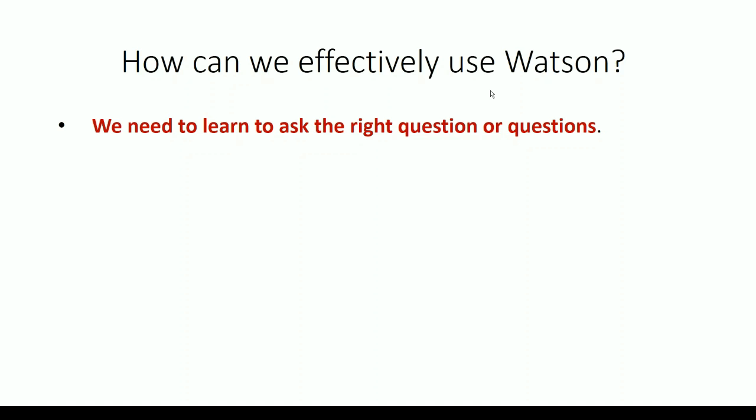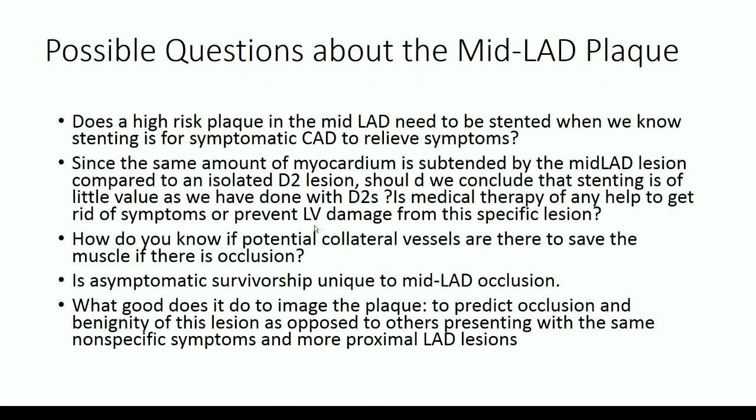So how can we effectively use Watson or cognitive computing? We need to learn to ask the right question or questions. So let's look at the 2 cases that we've been working on and see what the questions might be. So, possible questions about the mid-LAD plaque. Does a high-risk plaque in the mid-LAD need to be stented?